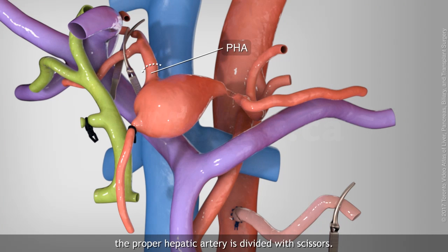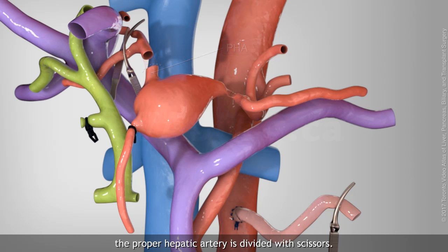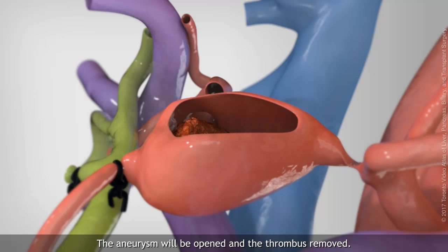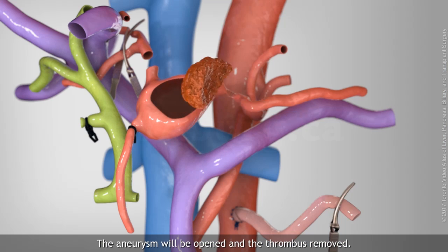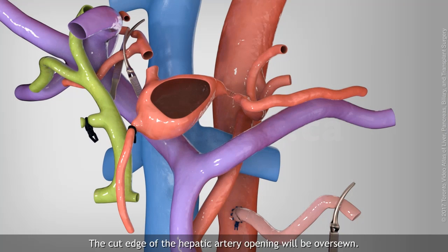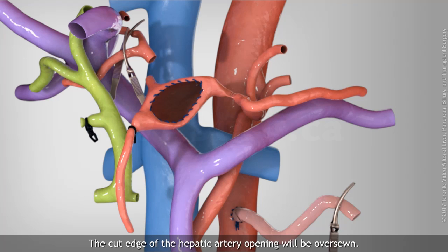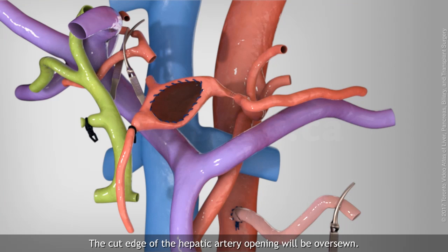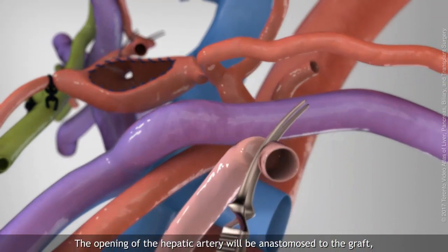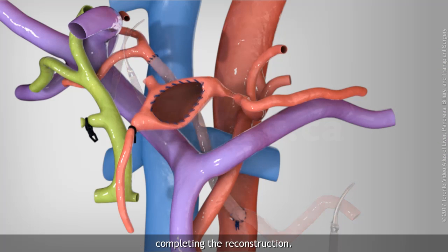The proper hepatic artery is divided with scissors. The aneurysm will be opened and the thrombus removed. The cut edge of the hepatic artery opening will be oversewn, and the opening of the hepatic artery will be anastomosed to the graft, completing the reconstruction.